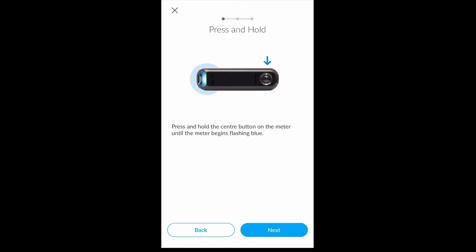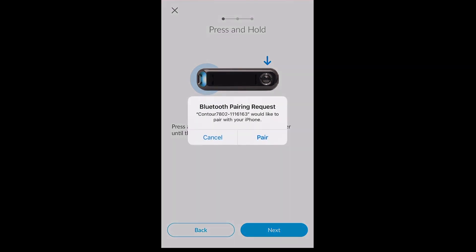You will find that the app will pair directly with the device in question. As you can see here, I am pairing a Bluetooth device. You may be prompted on screen to pair the device with your smartphone — if so, click pair.